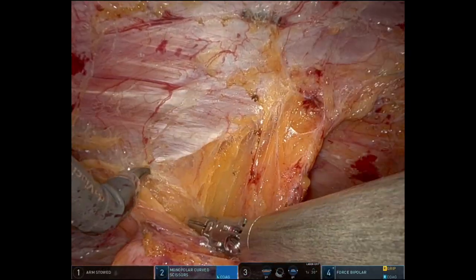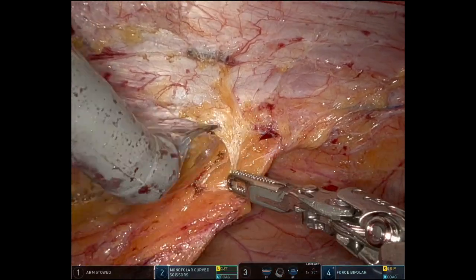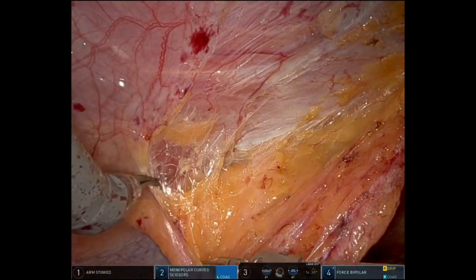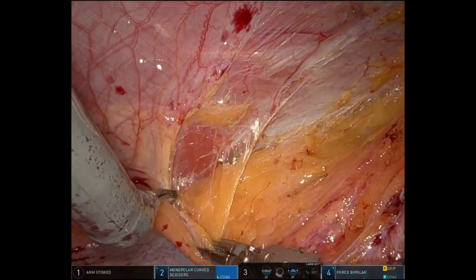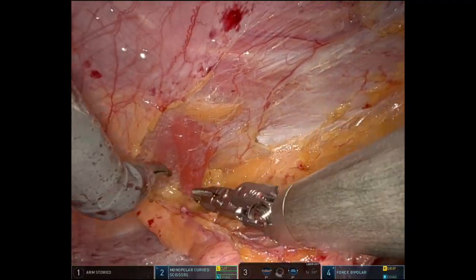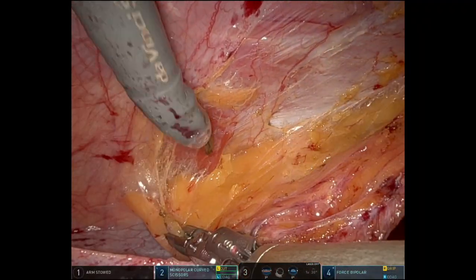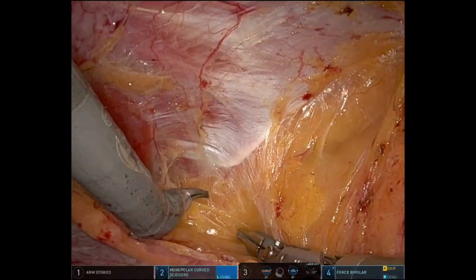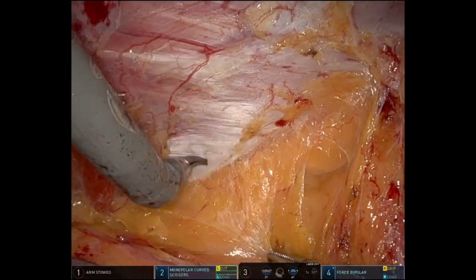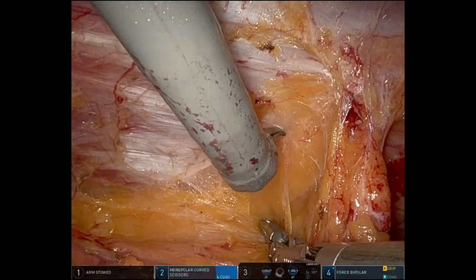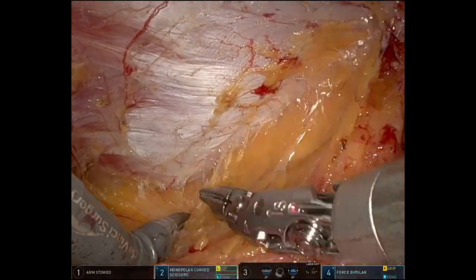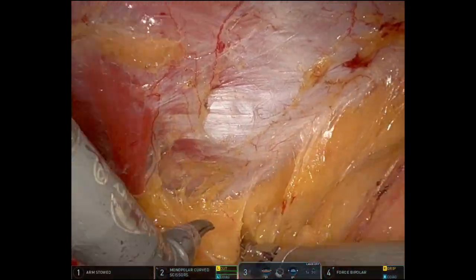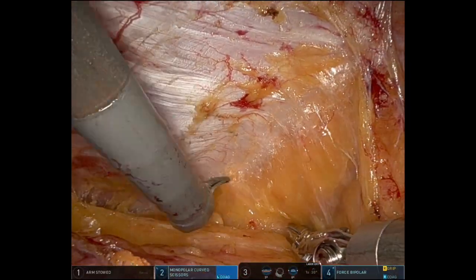I decided to perform a preperitoneal hernia repair by starting up high cranially and dividing the falciform initially. I docked the patient on the right side initially because the patient had a previous history of colostomy reversal on the left side, so I also had to close that defect. I decided to dock on the patient's right side initially.